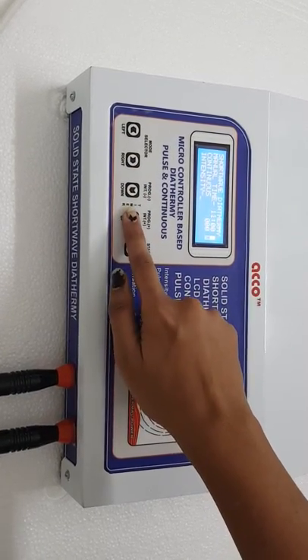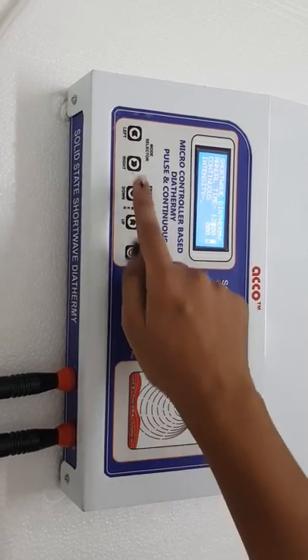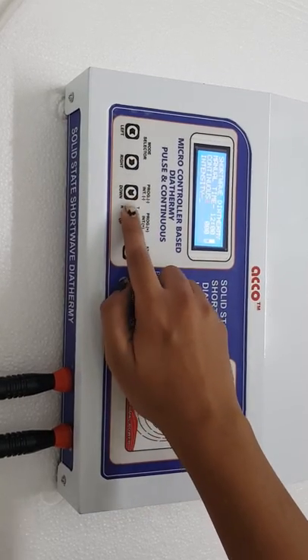Select the timer as per your need — timer up or timer down. Select the mode as per your need: continuous or pulse.